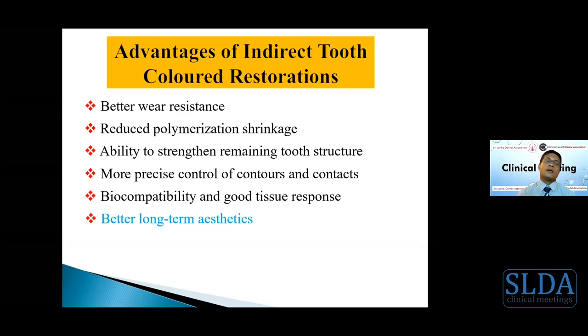These are the advantages of indirect tooth-colored restorations. They have better wear resistance, reduced polymerization shrinkage compared to direct fillings, and they reinforce the remaining tooth structure and can have ideal proximal contacts, marginal integrity, and excellent morphology. They are biocompatible and they exhibit good tissue response due to lack of pulpal irritation and decreased dentine hypersensitivity. Out of all, the most important has been their ability to provide long-term aesthetics.